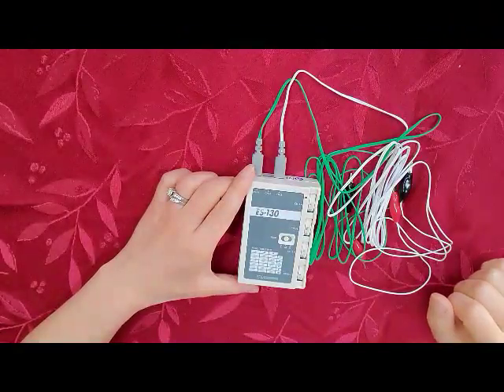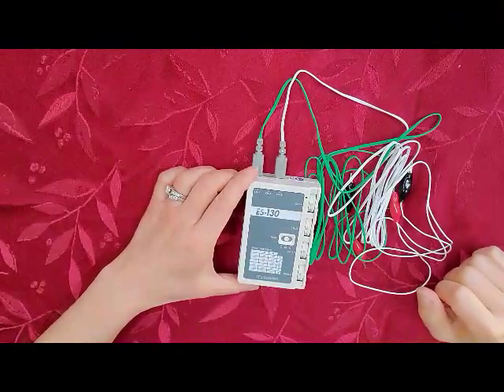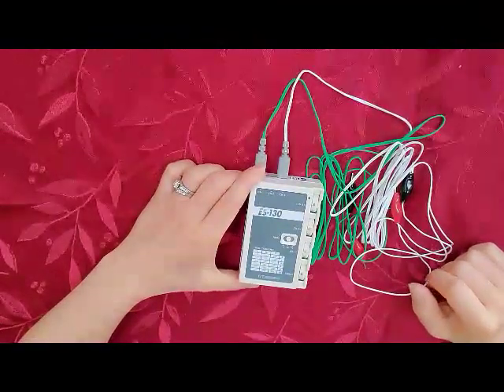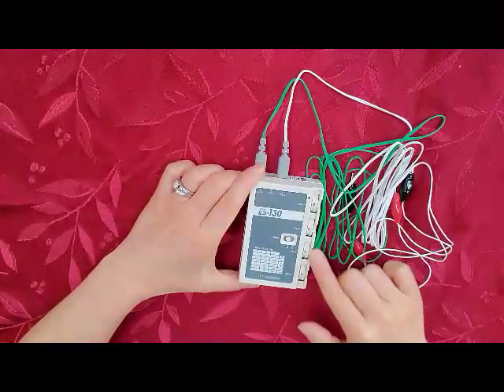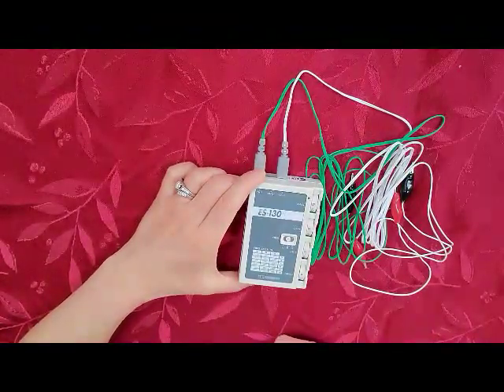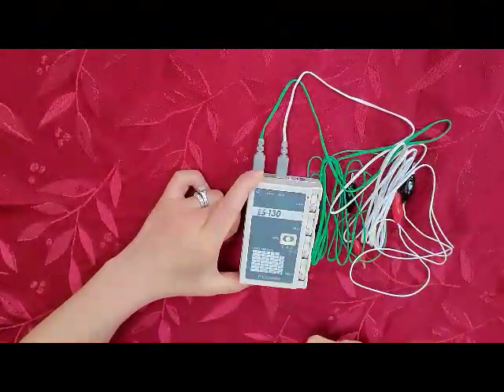In this video, I'm going to demonstrate setting frequencies on the ETO electrostimulator. When you first get out your electrostimulator, you want to be sure that all of your channel settings are in the off position, as you can see here. Next, you'll notice that I already have leads inserted in channel 1 and channel 3.